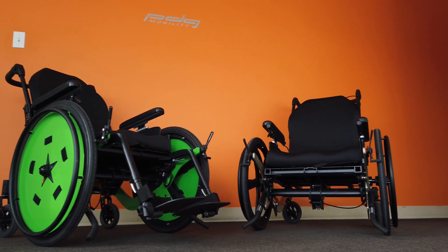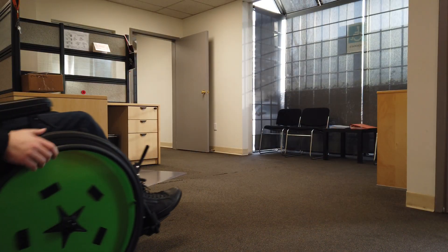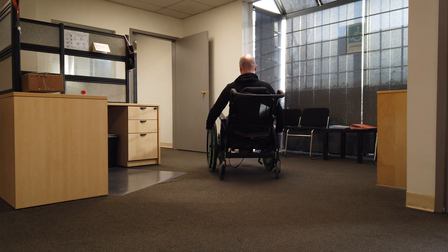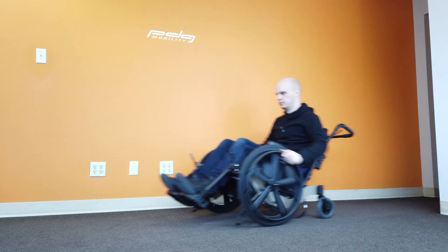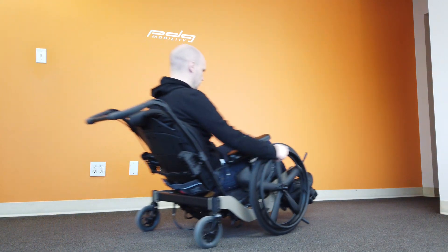Introducing the PDG Mobility Bentley LTR Lightweight Reverse Layout Wheelchair. The Bentley LTR is a lightweight tilt-in-space wheelchair designed with the drive wheels out front. Having the larger wheels out front allows for easy and ergonomic access to the drive wheels throughout the entire range of tilt. It also improves the maneuverability of the wheelchair.